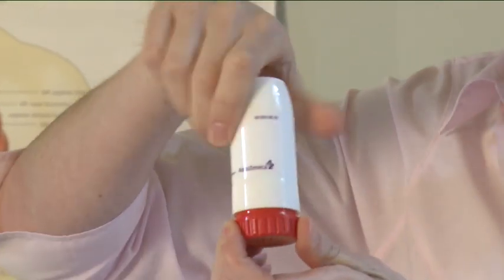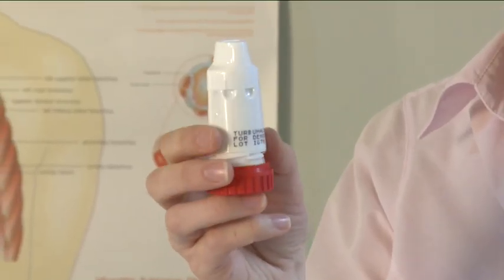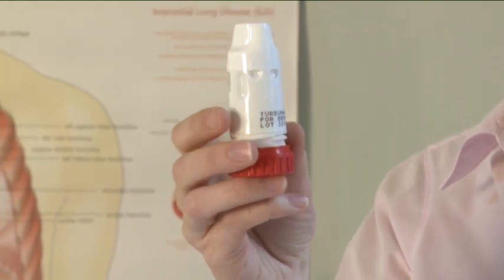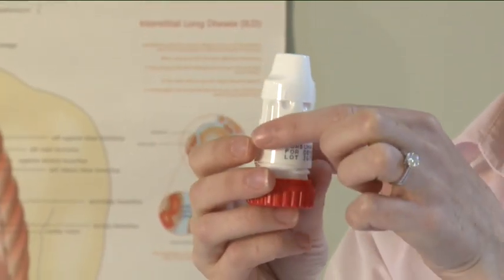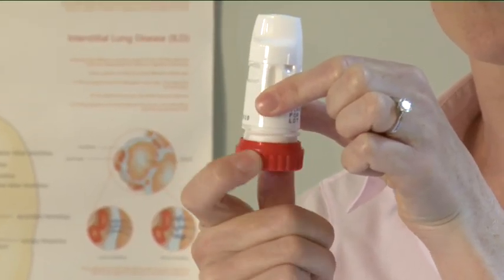Unscrew the cover and lift it off. You may hear a rattling sound. This is a desiccant to keep the powder dry. Hold your Turbohaler upright with the red grip at the bottom. Turn the red grip as far as it will go in one direction, then turn it as far as it will go in the other direction. It does not matter which way you turn it first.